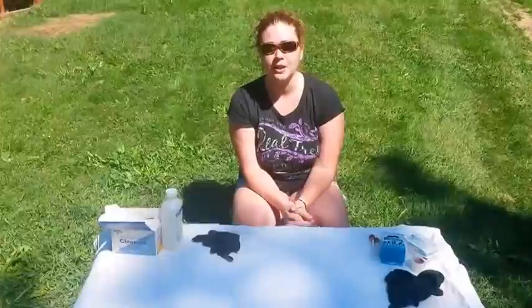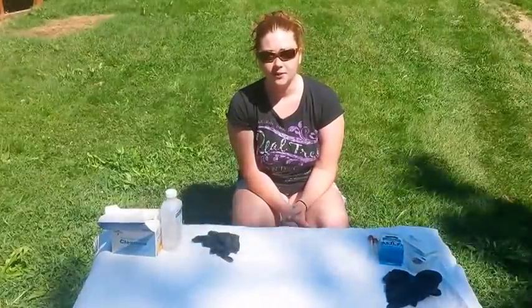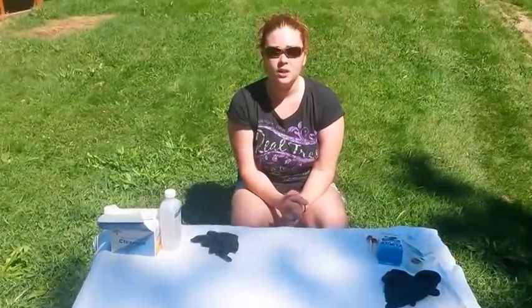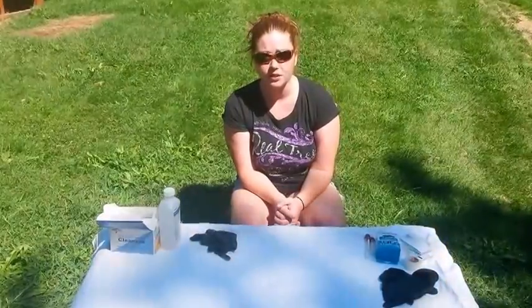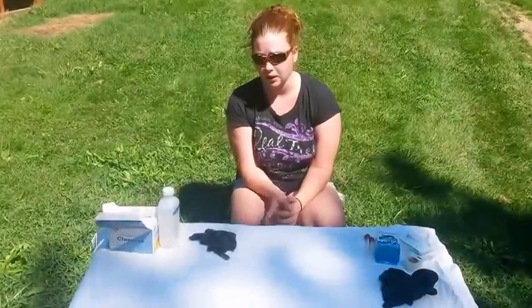Hi everyone, it's Lauren from Old Orchard Farms. Today I'm going to do a video to show you guys how you draw blood from poultry. I am a state tester for the state of Virginia. We do this to test for MG, MS, and many other diseases that come in poultry.